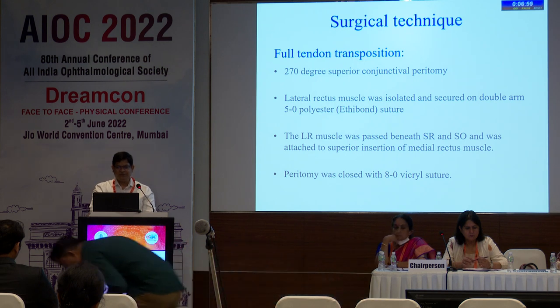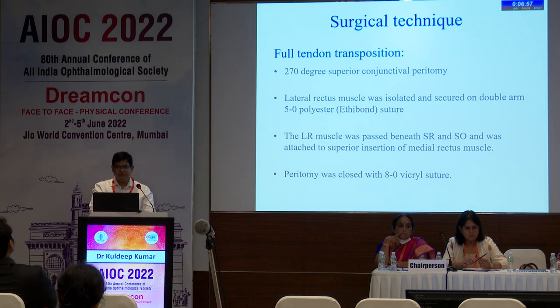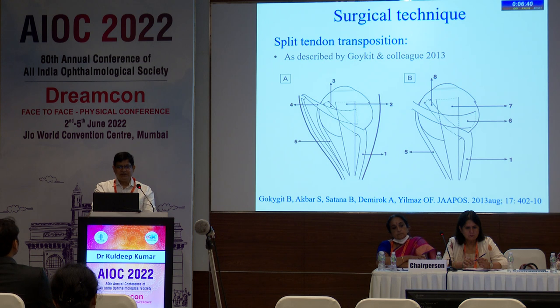In full tendon transposition, a 270 degrees superior conjunctival peritomy was done and the lateral rectus was isolated and secured on a double-arm 5-0 polyester suture, and the LR was passed under the superior rectus and superior oblique and was attached to the superior insertion of the medial rectus. Split tendon transposition was the technique which was earlier described by Goldkeit et al. in 2013.